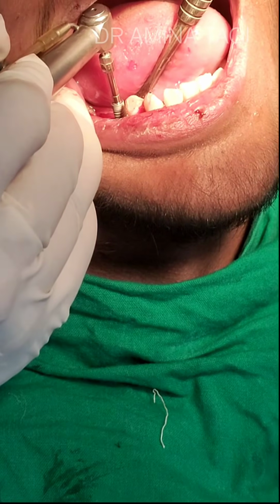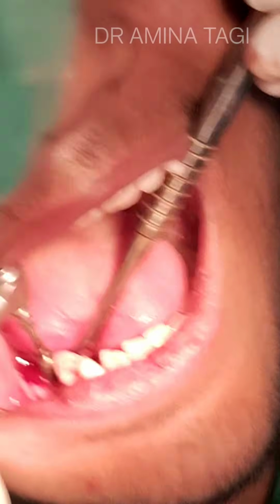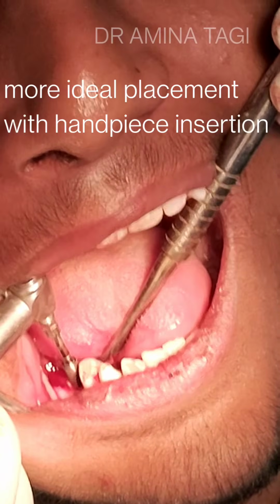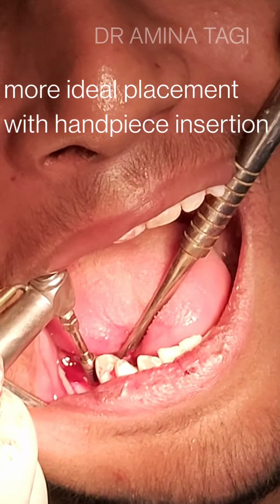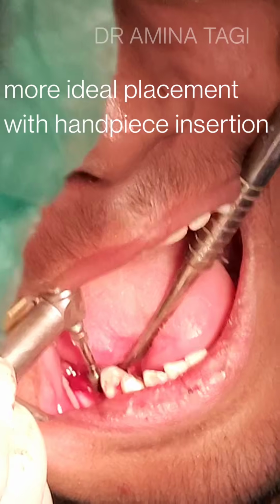You can insert the implant by a handpiece, or you can insert it with a hand ratchet. The advantage of inserting the implant with a handpiece is that the placement will be more ideal and deviation is less likely. So you can see I am inserting the implant with a handpiece.